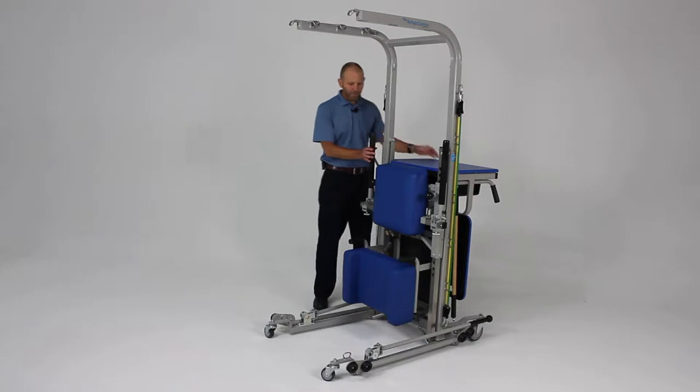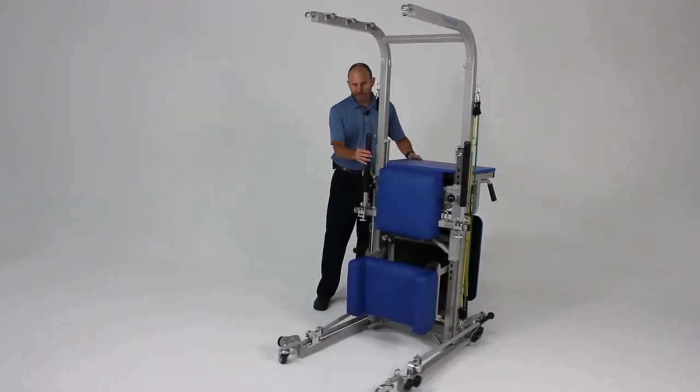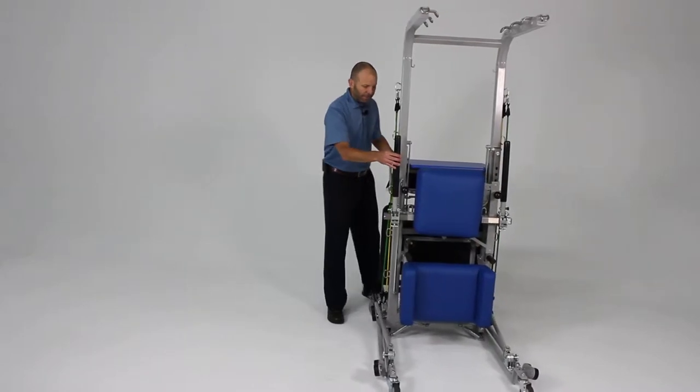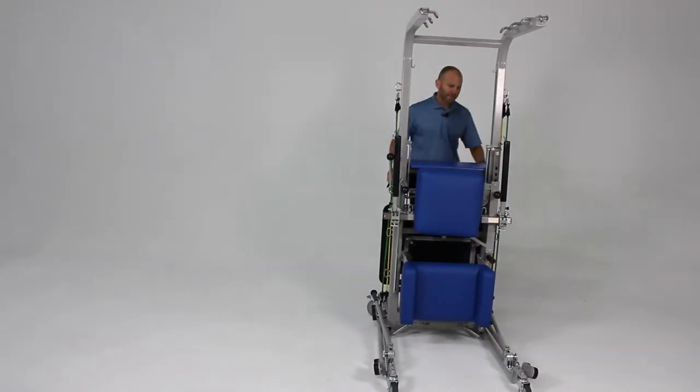First of all, this is a portable unit so it can be moved, taken into rooms, taken down hallways. If you would like to lock it in place, there is a stabilizing feature.